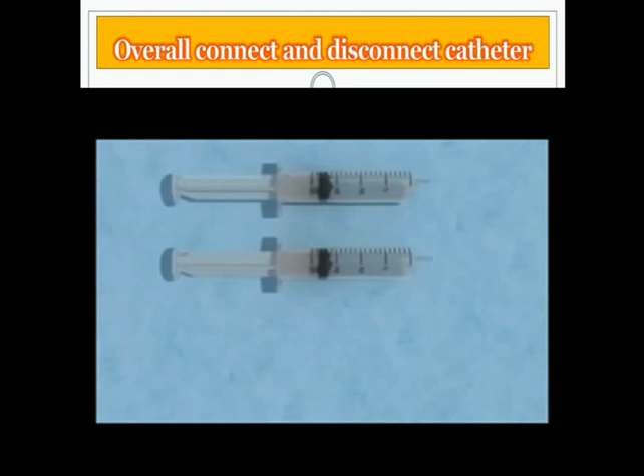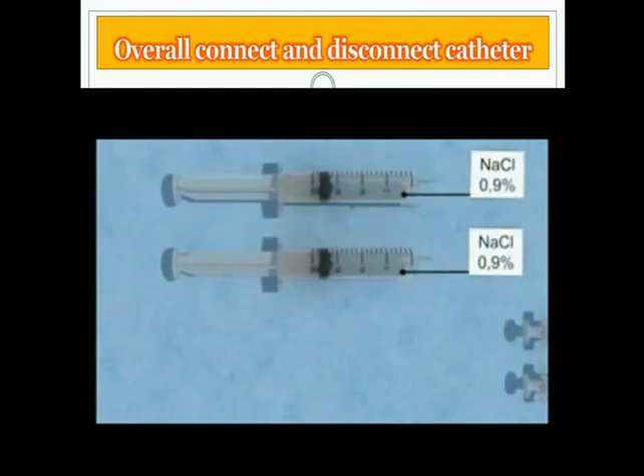This animation demonstrates how to connect and disconnect hemodialysis catheters using CitroLock catheter lock solution. To start the treatment, the following items are needed: two 20 milliliter syringes filled with sterile 0.9% saline solution, and two empty 5 milliliter syringes for the aspiration of the former used CitroLock. The procedure should be performed using an aseptic technique, and the patient is placed in Trendelenburg position.